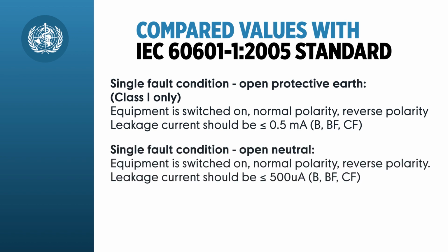Single fault condition, open neutral, N. Equipment is switched on, normal polarity, reverse polarity. Leakage current should be less than or equal to 0.5 milliamp, B, BF, or CF.